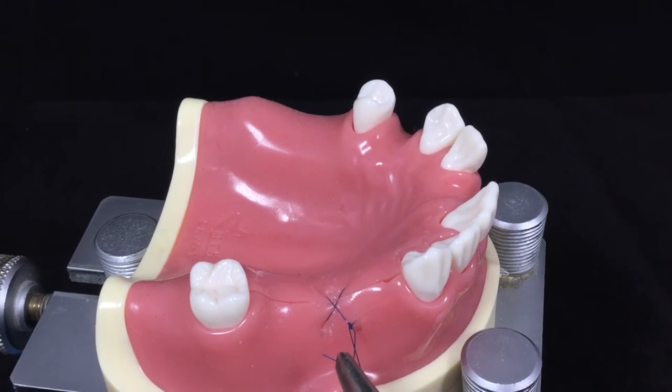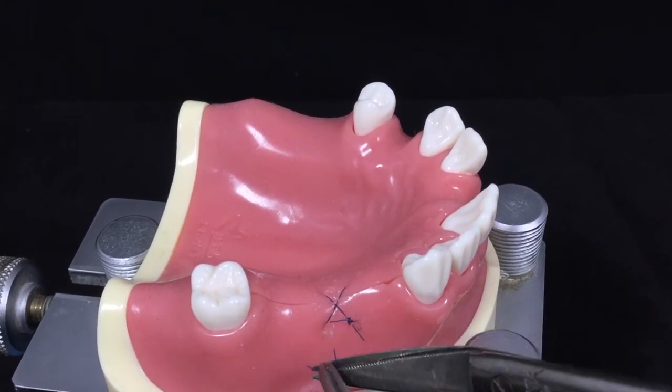This is called the Hidden X crossed mattress suture.